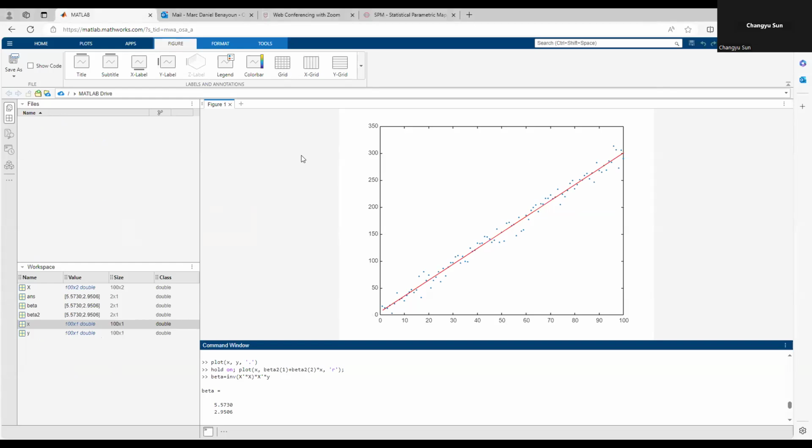Right. Have people done things such as dividing up their experiment maybe in 3 parts, have 3 solutions, and if you find, let's say, random effects because of your 5% significance level, the likelihood that you will find the same voxels erroneously is small, isn't it? So an overlay of 3 separate ones could maybe tell you something. Is that something that people do?